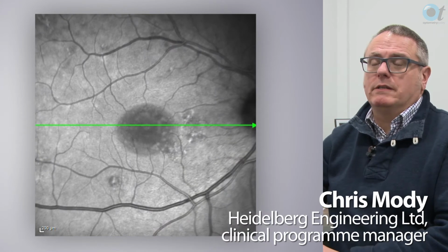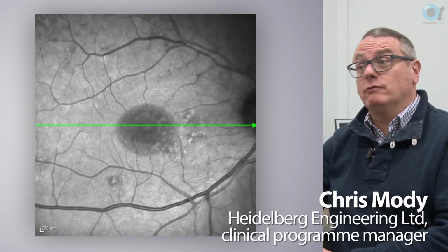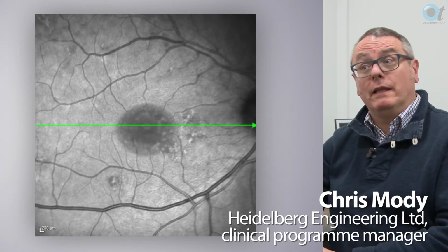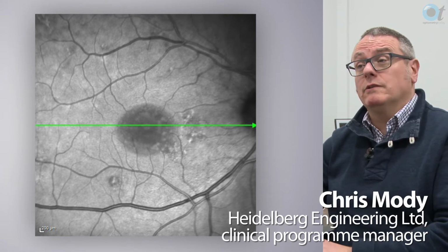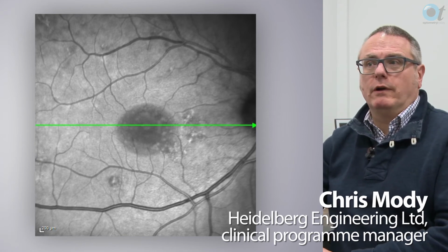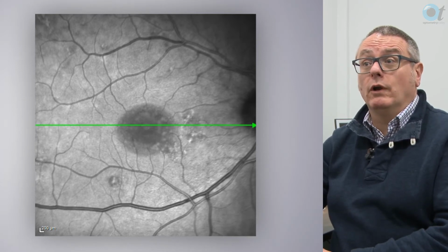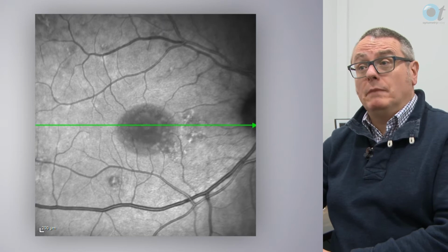Thank you. When it comes to assessing OCT images, start with the basics. So you're provided with a fundus reference image. Look at that. It's a familiar image. You're used to doing fundoscopy, so let's start with a familiar image. Now, this is an infrared reflectance image, and we'll pick up a number of changes very effectively. It picks up fluid within the retina, underneath the retina or underneath the RPE, and it'll pick up pigmentary change within the RPE.